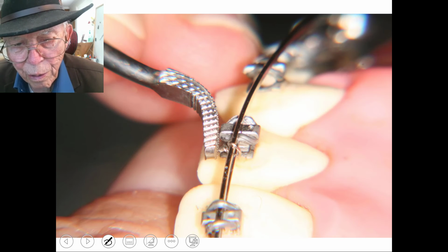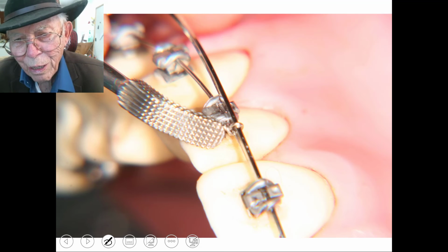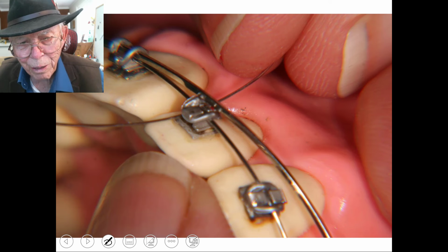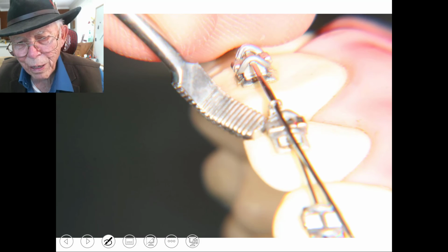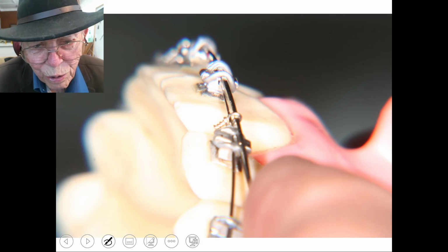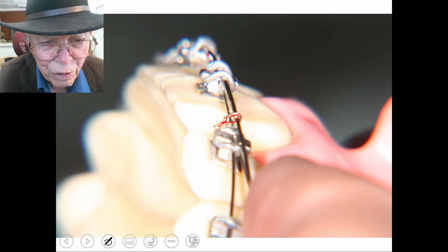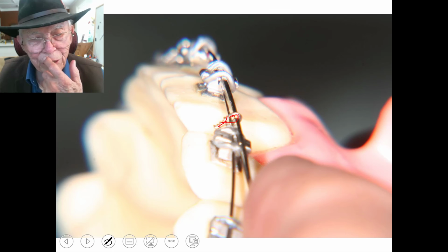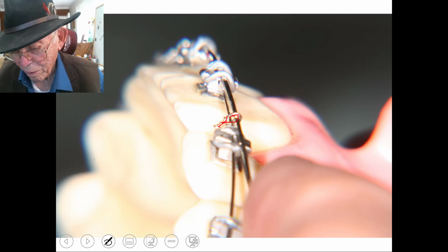Now I'll go in, we'll tie it. I'm pushing it back with this plier right here, just pushing that little tail end back, and now the two wires will kind of slide in this thing, and it'll just slip around, and it'll go back, and then it stays back. You can see that once you get the wires back behind, like that, they'll stay there. Now this twisted part will stay there because it's on a kind of oval shape. If this pops out, it'll bug the heck out of the person. It rubs their lip, it'll cut your lip, but you twist it back and it'll stay there. You won't have any trouble with it coming out at all.